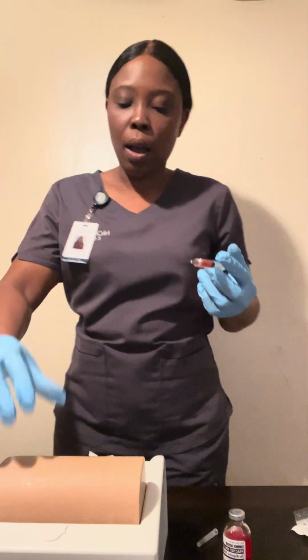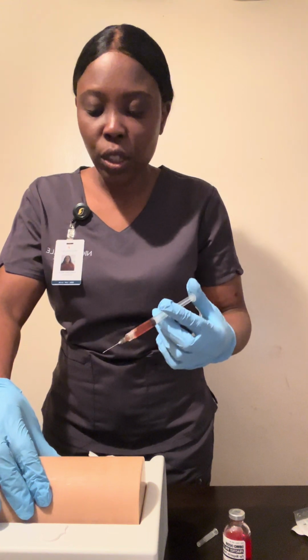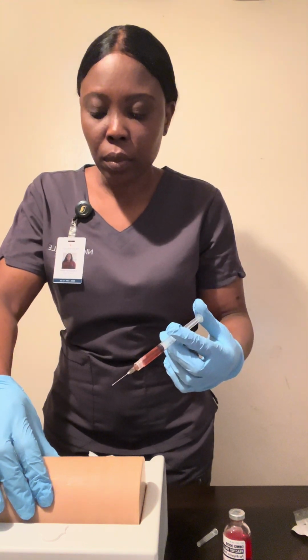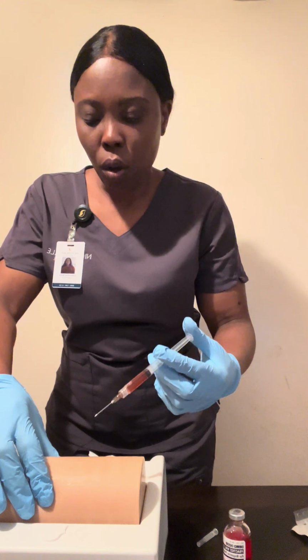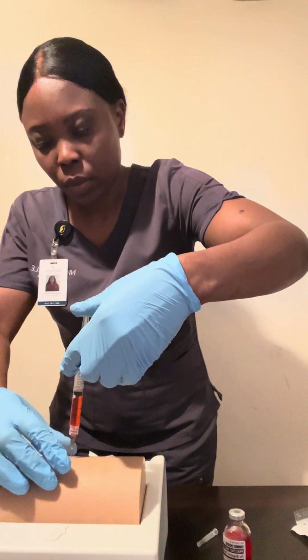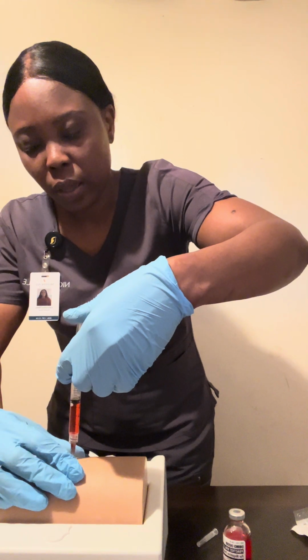Okay, now I'm gonna hold the skin, and then I'm gonna inject the medication at about a 90 degree angle.